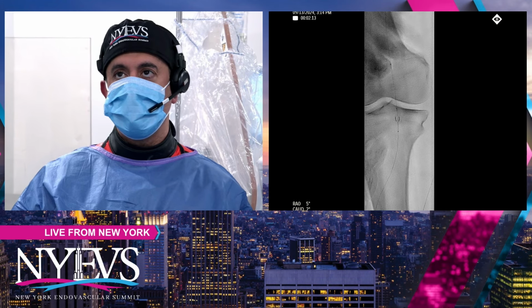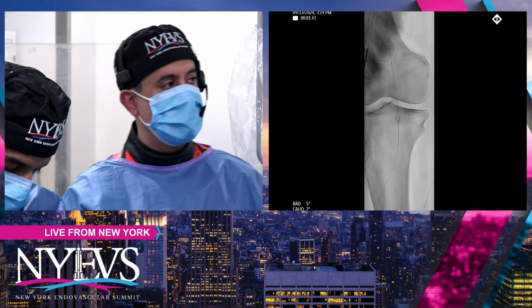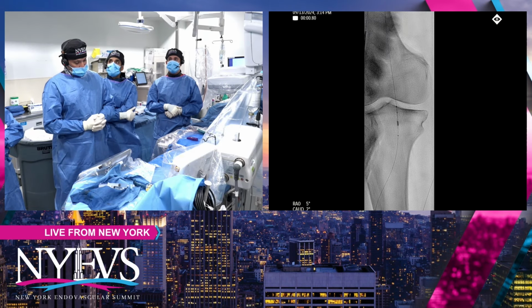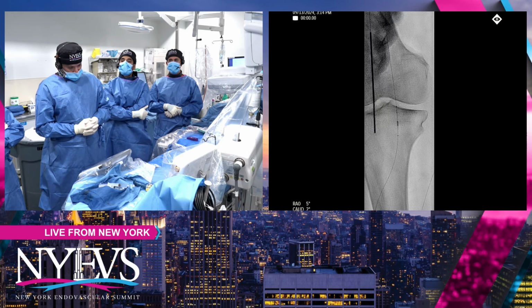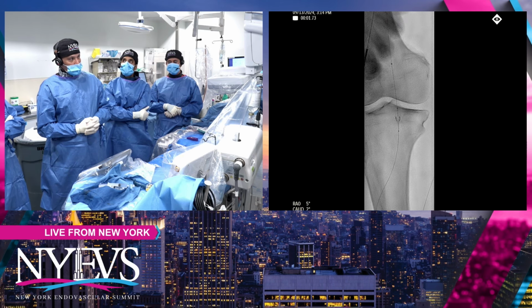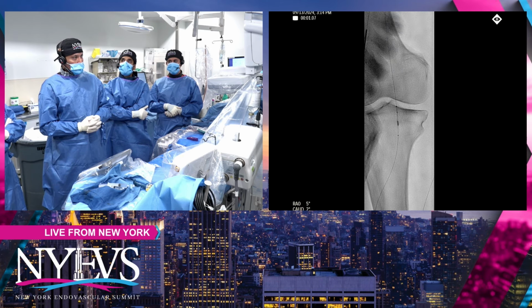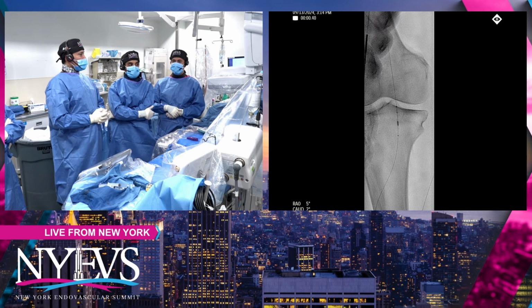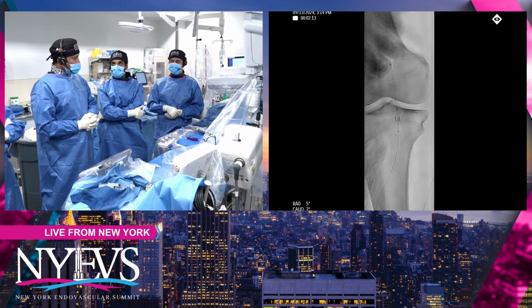Yeah, so we have a very esteemed panel, and we'll ask what everyone's strategy was. I think the other point to make, there's a little bit of protection with the stents, but when you go 8 French and you had the difficulty that you had, there's a lot of tension on that system. So when you come out with that, how are you planning to come out protected, so you're not dragging along the aortic bifurcation, because that obviously can lead to some bad complications every once in a while?